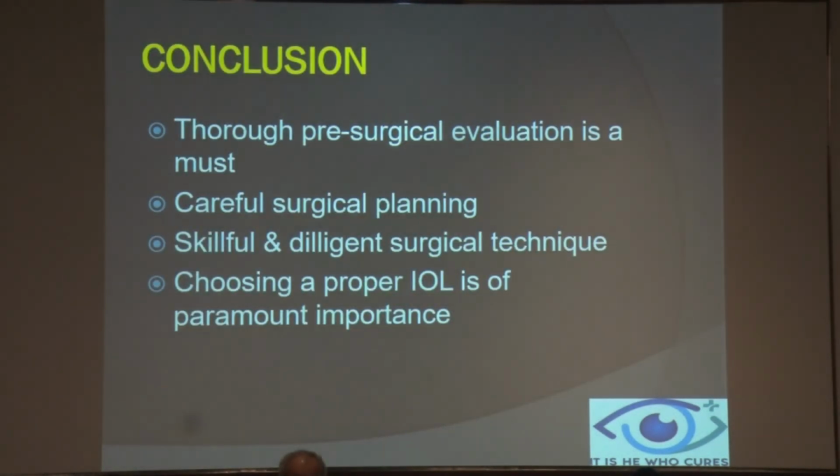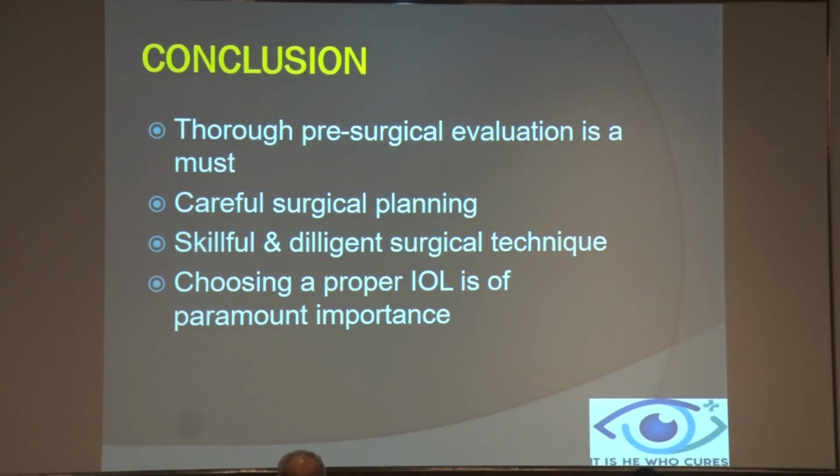So to conclude, a thorough pre-surgical evaluation is a must in all our cases. With careful surgical planning and skillful and diligent surgical technique, you will get good outcomes and will have good results. And choosing a proper IOL is of paramount importance. You should have a good inventory with you, and whenever you land up into any problem, any mishap occurs, you can always go and put the right IOL. Thank you.